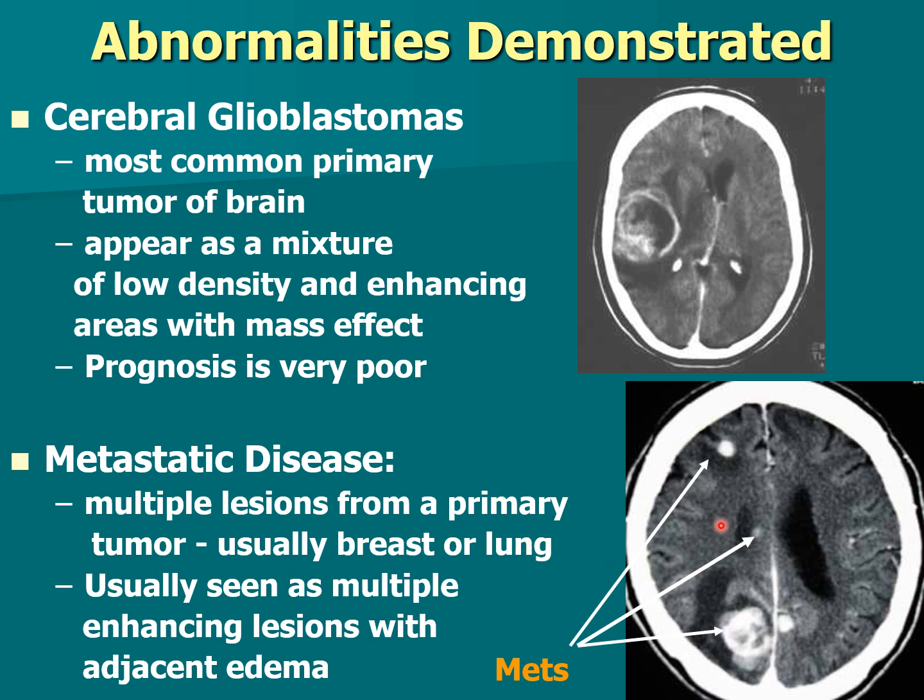cancer can metastasize to the brain, and usually mets are going to be small focal lesions, and they may be all over the brain here, because when you see multiple little lesions, it's usually from metastasis. Usually, a primary is going to be one lesion that grows, and you can see that this lesion has caused a mass effect. It's pushed the brain over to one side. Whereas these have not had as much mass effect because they're smaller and they're throughout the brain.